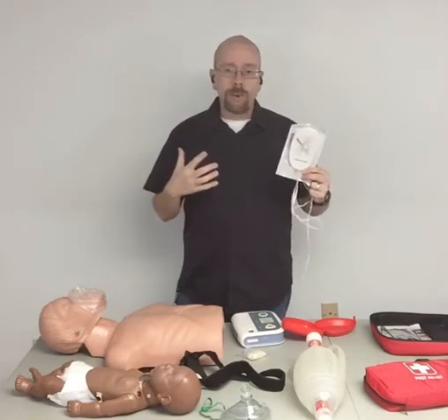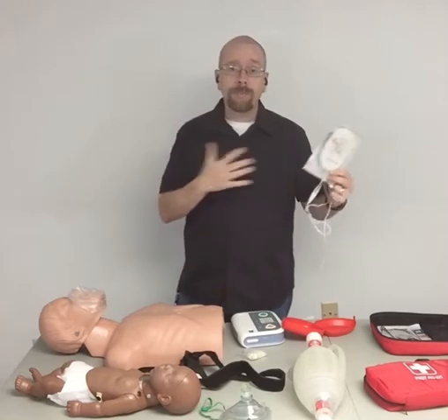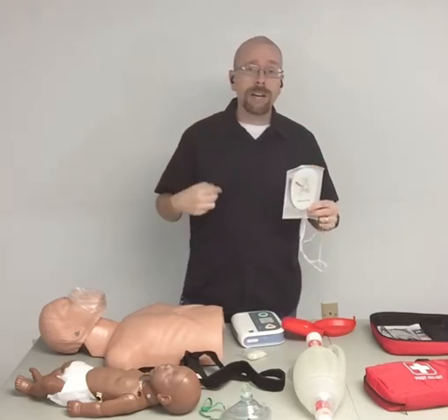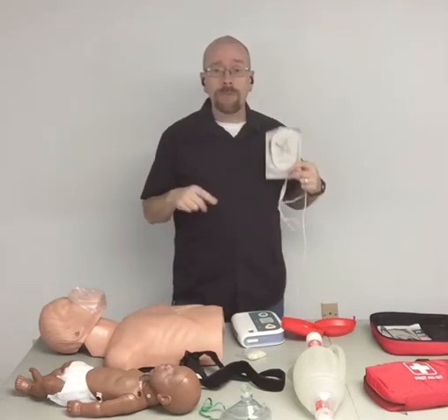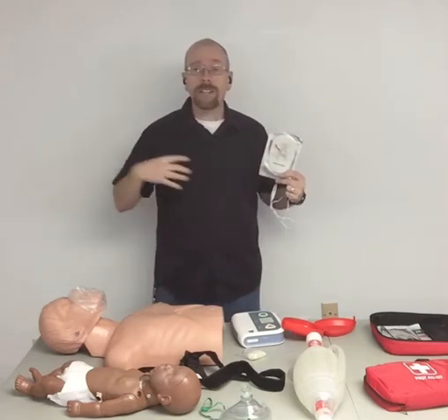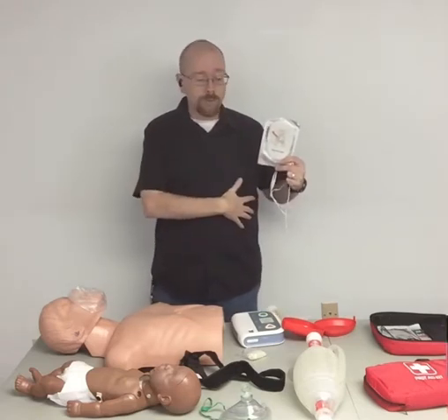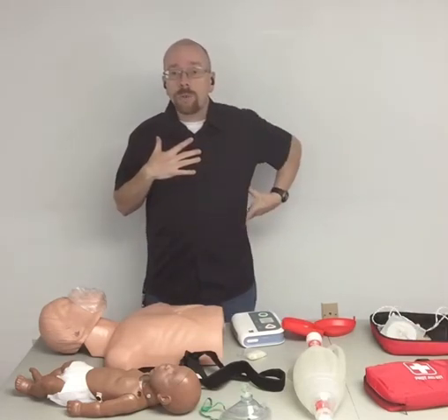In a lot of cases, the person's heart is on the left side. In my 30 years, I think I've met 2 people that have their heart on the right side, and then you would have to switch the pad placement. But for the most part, the pictures on the pads are usually right. The person's heart's on the left side, right clavicle, left lower ribs. If for some reason the pads are too close together, we always move this pad more towards the back.